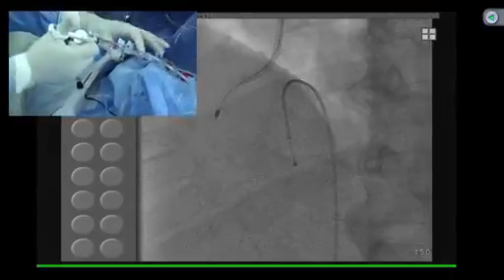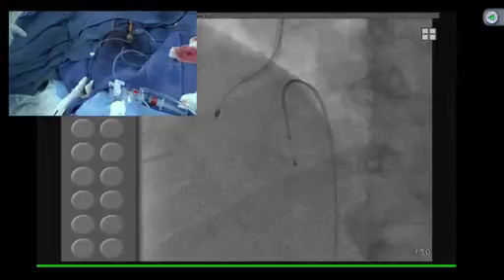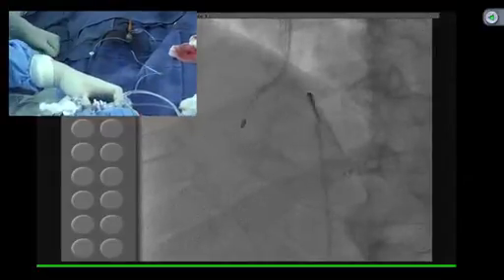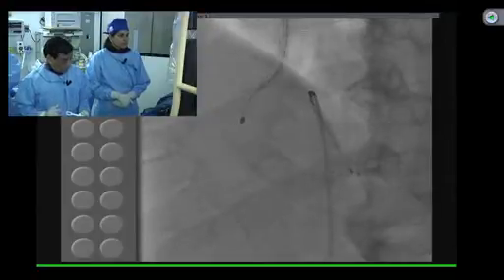Annu, that's an excellent demonstration, and several people had asked us exactly to demonstrate those precise movements. Now clearly you are going to proceed with the single burr strategy here, no?